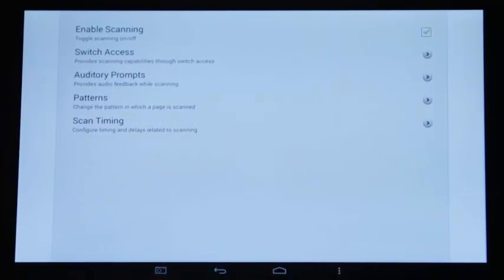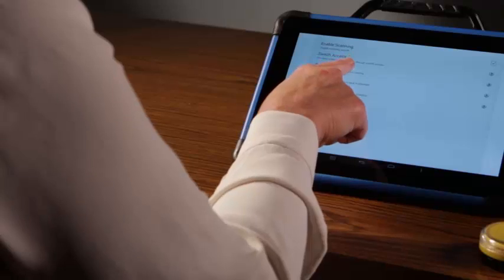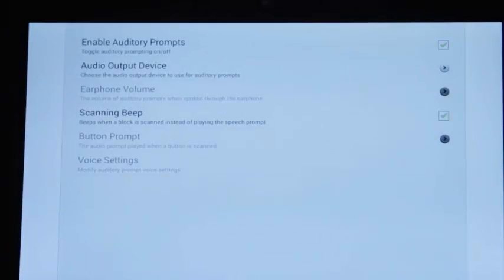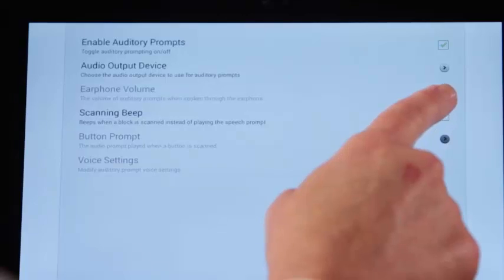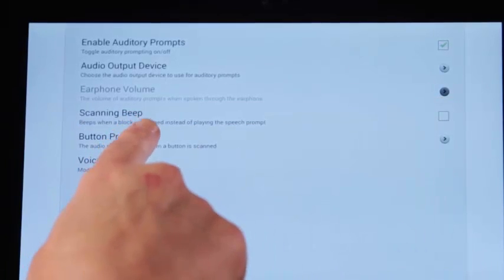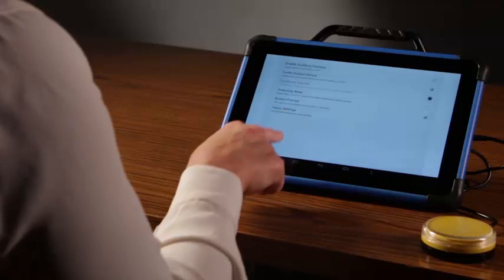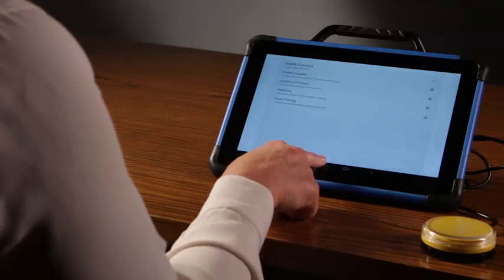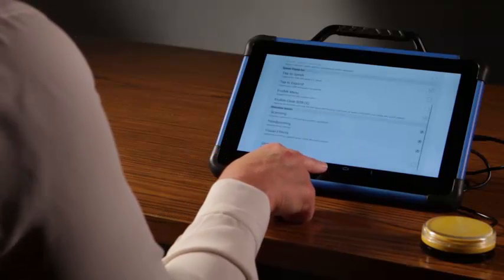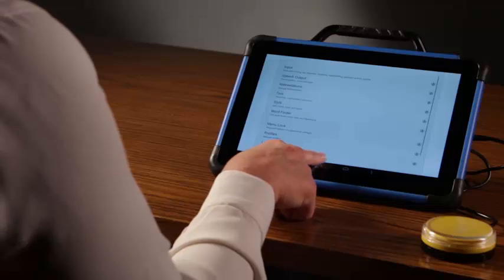Now I will look at the auditory prompts. Tap Auditory Prompts, enable auditory, and turn off the scanning beep. Tap Button Prompt and select Label for the auditory prompt. We will arrow back to the vocabulary.